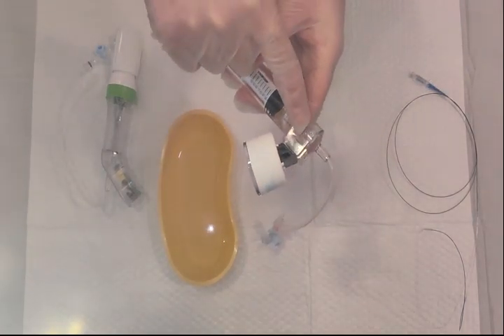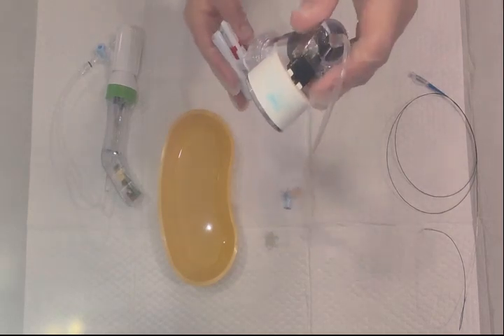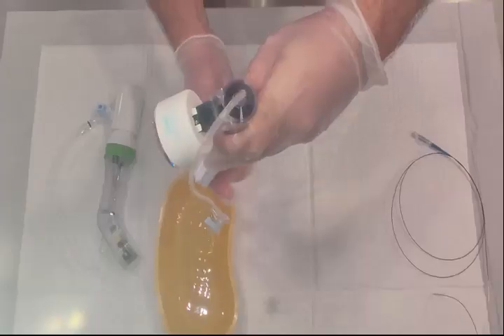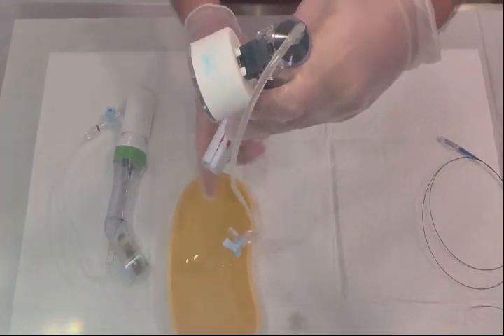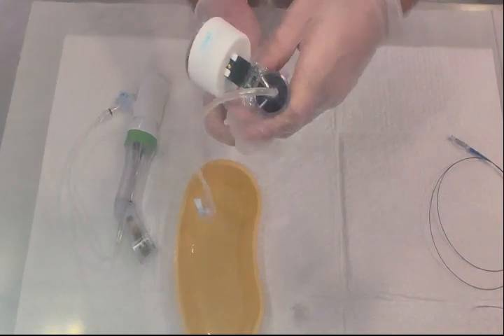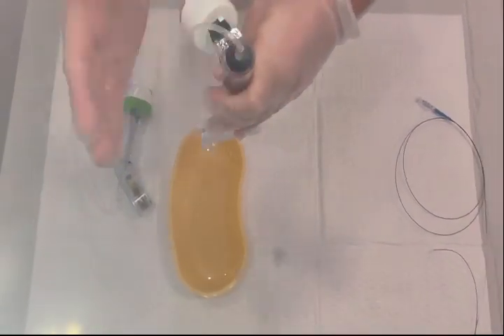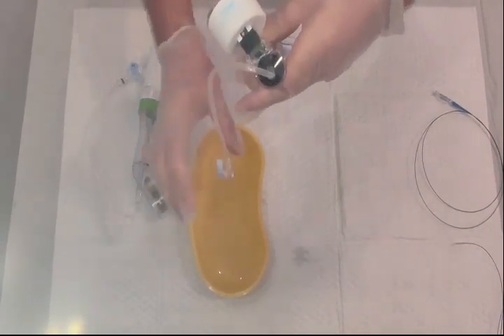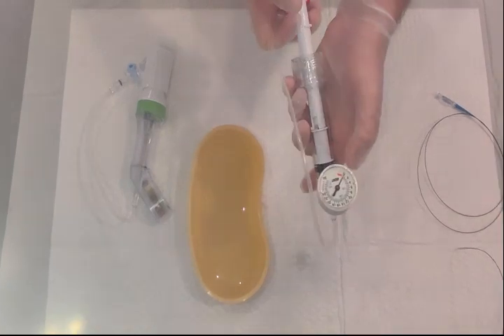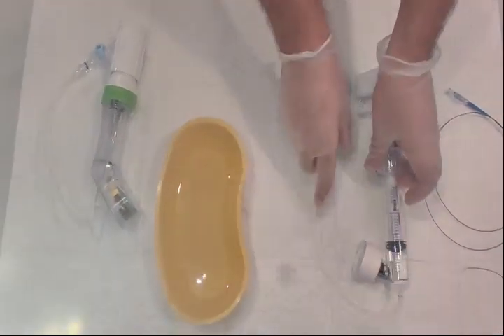After filling, there may be potential air trapped inside. To remove it, move the device upright and rotate it. You can also tap it on the top to release any remaining air bubbles. Once the air is removed, the inflation device is ready — the meter should be at zero. Set it aside.